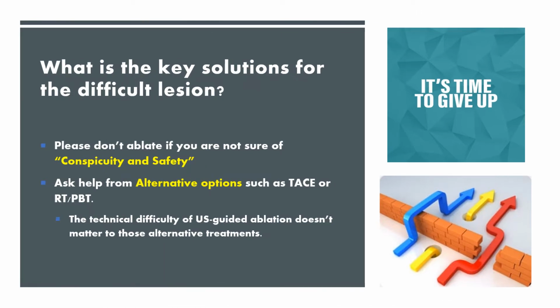What is the key solution for the difficult lesion? Please don't ablate if you are not sure of conspicuity and safety. Ask for help from alternative options such as TACE or RT or PBT. Technical difficulty of ultrasound-guided ablation doesn't matter to those alternative treatments.